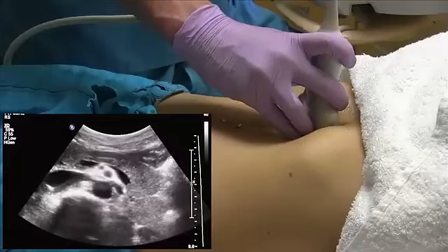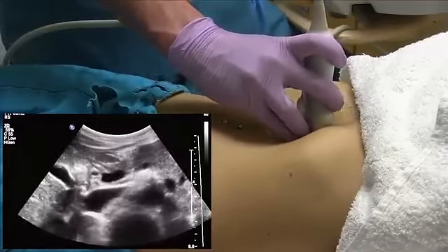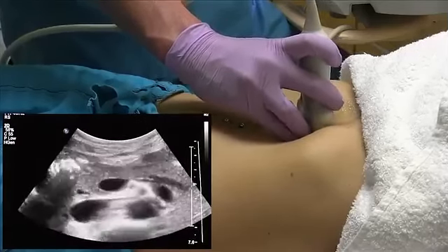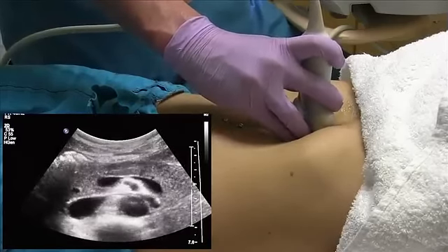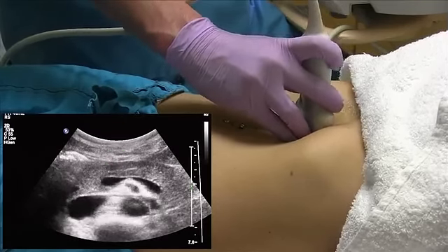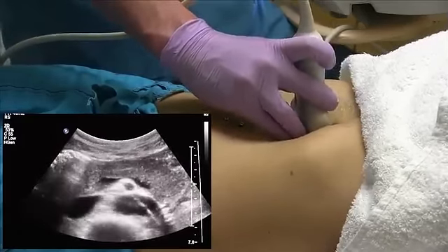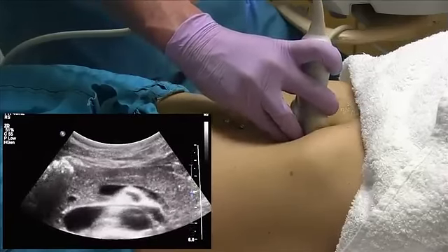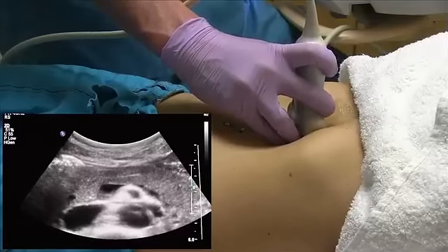When you're looking at the pancreas, you want to look for certain structures as well. One of the structures that we can look for is the pancreatic duct, and that runs right through the body of the pancreas, throughout the entire length of the pancreas. You can look here. In a lot of patients, you will be able to see the pancreatic duct, and we usually use 2 millimeters as a cutoff for our normal pancreatic duct measurement.